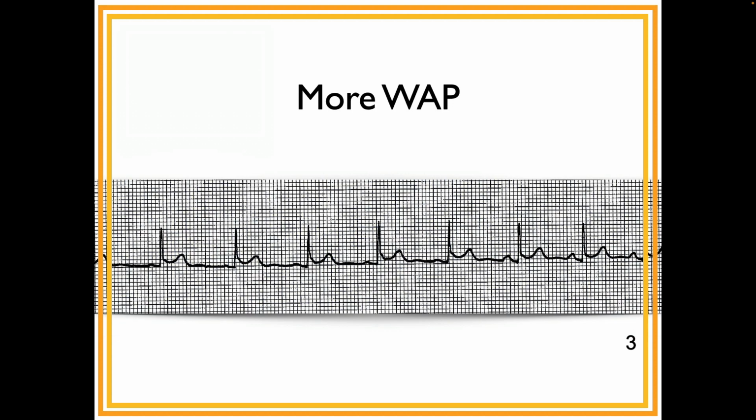Here's more. Again, it's characterized by weird P waves that change. Okay, so here we have some flat ones that then get bigger and bigger. Okay?